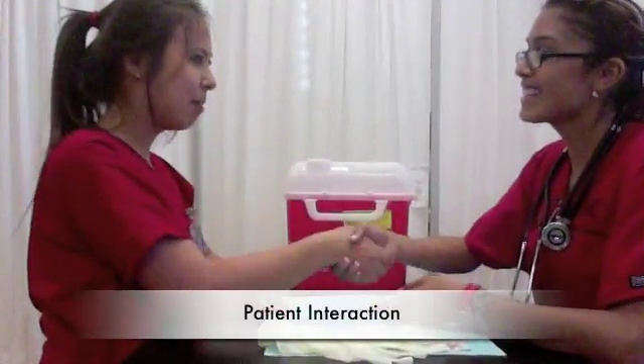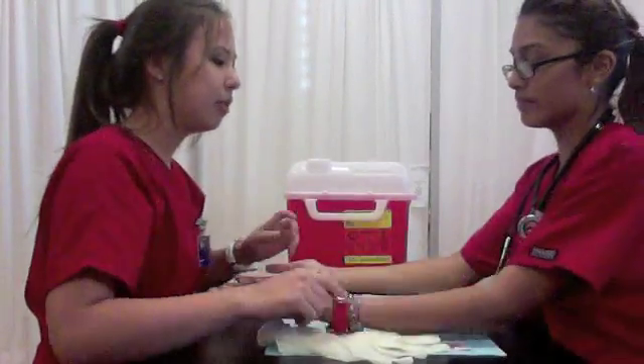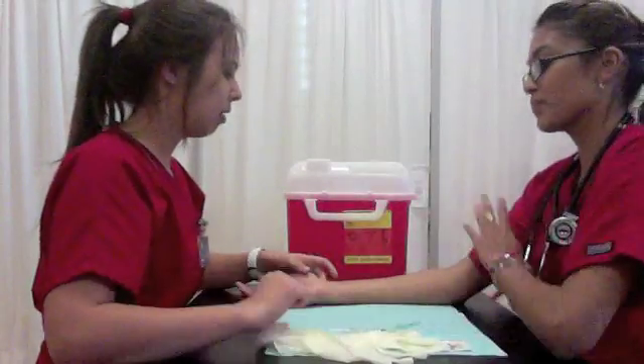My name is Susan Alvier, I'm a student. Hi, my name's Jenny. So the doctor has ordered a TB skin test, and you can do either of these two arms — this one or this one.